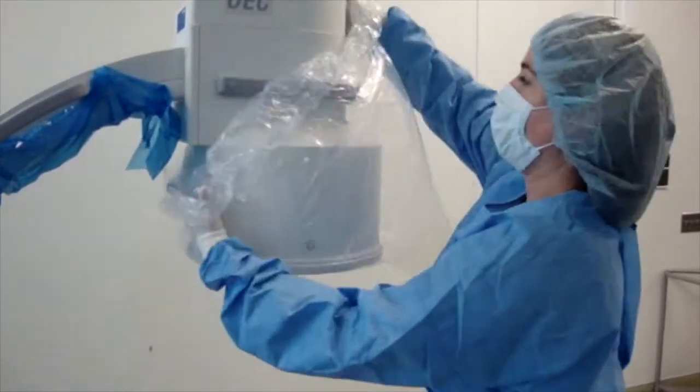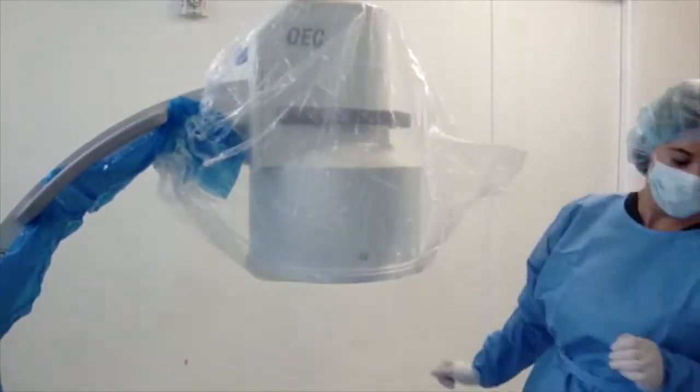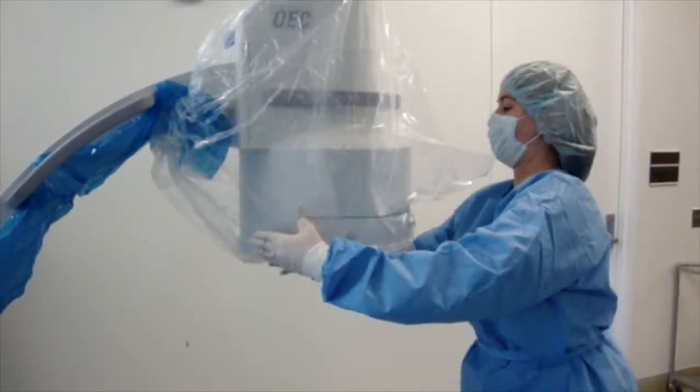After the drape is on, you have the option of applying a rubber band to the bottom of the image intensifier in order to prevent the drape from falling into the sterile field.